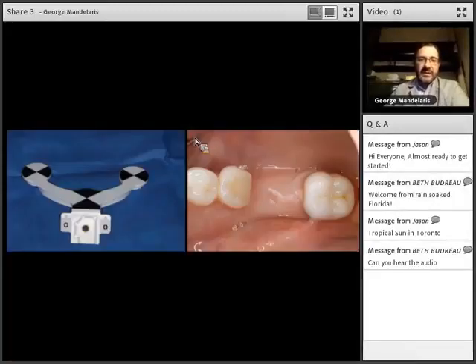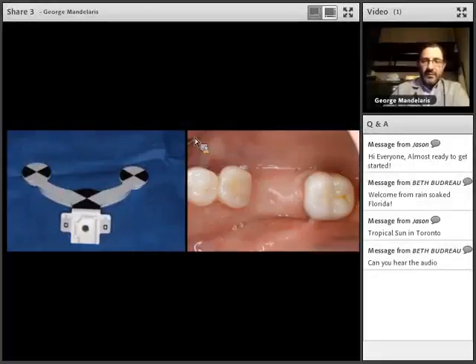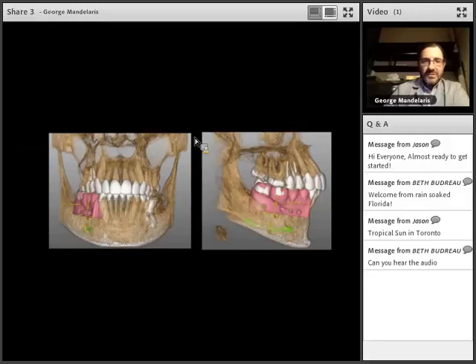So this is what we're using now to not only calibrate the drill axis, but also register the tips and register the ball point. Here's a case that we just did today. Tooth number 30, socket bone grafting was recently performed, CBCT imaging, and then we're registering the STL file and the Trios 3Shape scan. The lab has done a digital diagnostic wax-up. That wax-up has been signed off by the restorative dentist or prosthodontist, and now I'm going to map that tooth out. That's important for me.